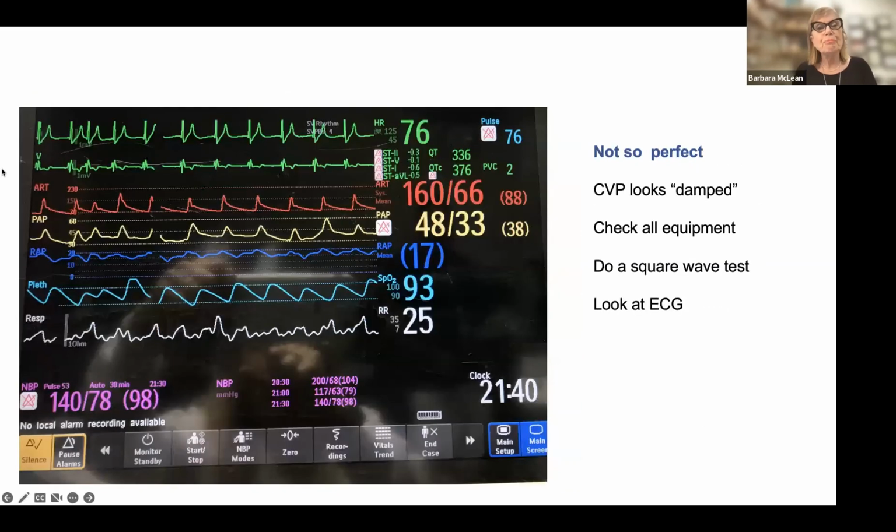Okay. Now I look at this patient. This patient, not so great. This patient doesn't look so good. I'm going to start off with his EKG. By the way, I don't really see any P waves here. If you don't have a P wave, you can't have an A wave, because you got to have a P wave to have an A wave.